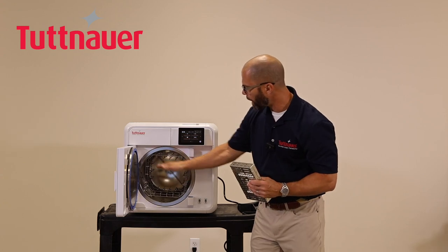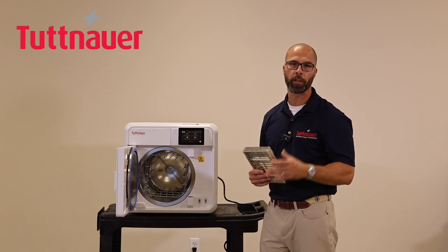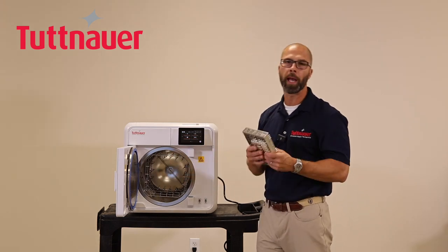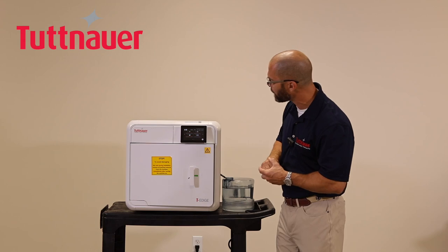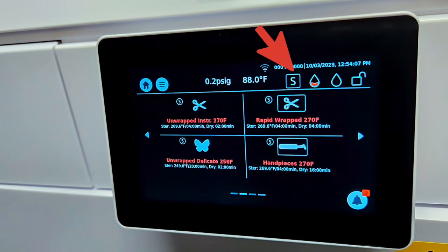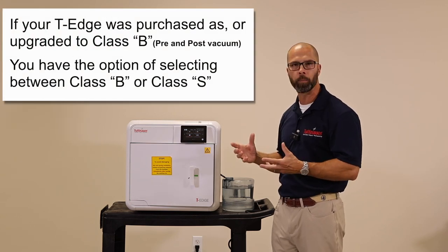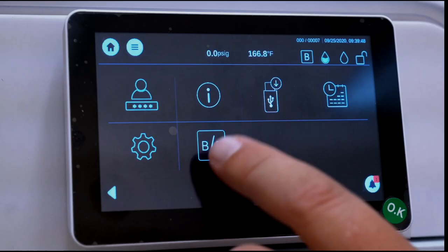The single tray rack can hold all five included trays, or you can remove the trays and insert cassettes either horizontally or vertically based on cassette size. You'll also see an 'S' or 'B' indicator on screen — this sterilizer is unique in that it can operate as either a Class S or a Class B sterilizer, and it's the only unit of its kind that can switch between the two.